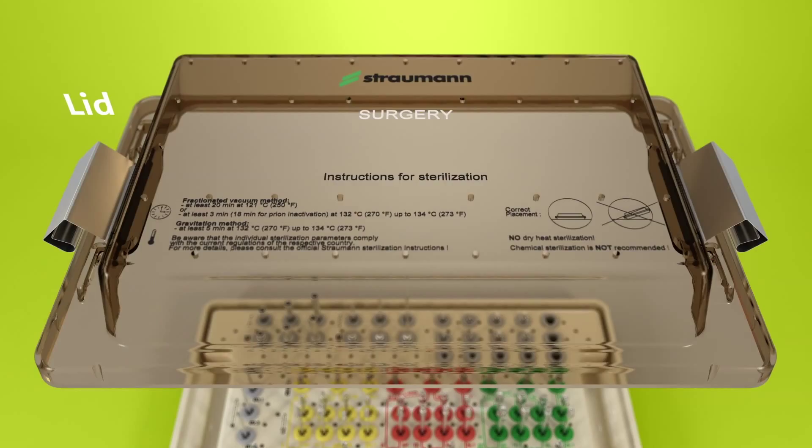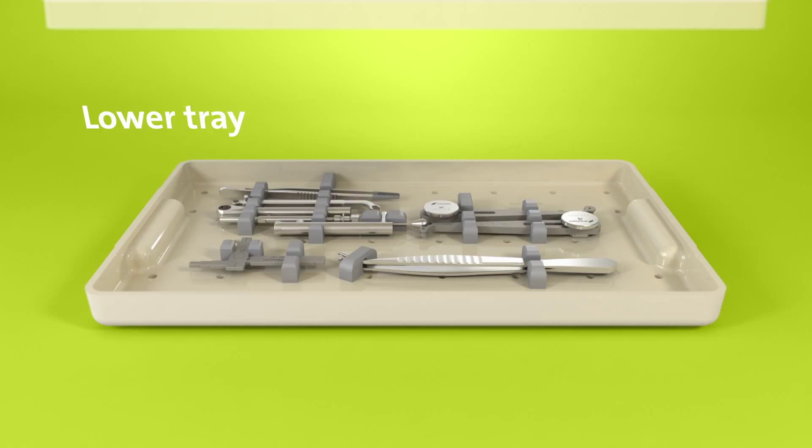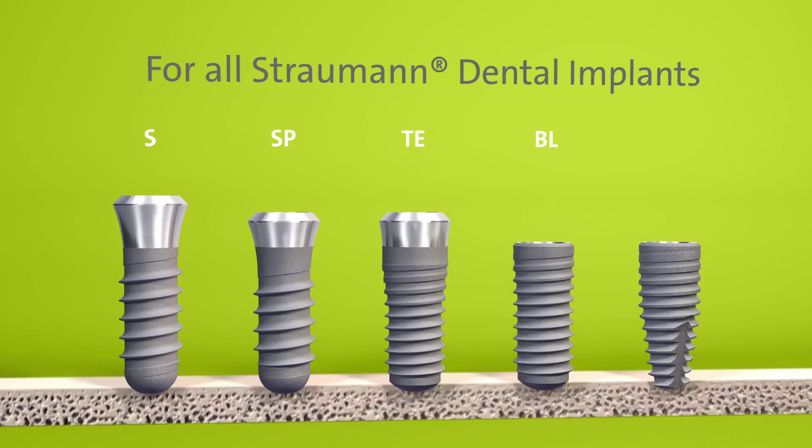The Straumann Surgical Cassette consists of three components: the lid, the upper tray, and the lower tray. The preparation of the implant bed is done by using one surgical kit for all Straumann Dental Implants.